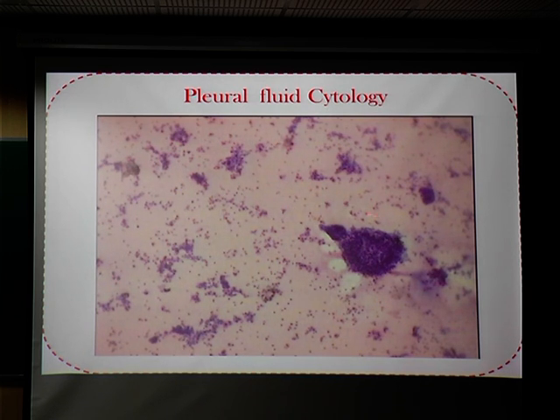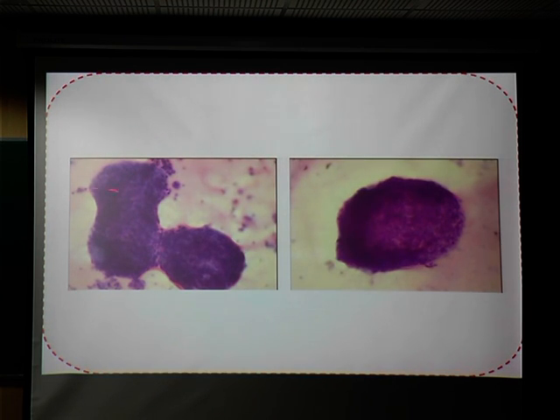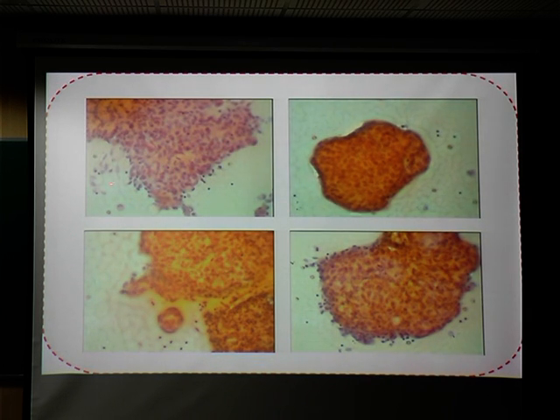You were getting these cell balls or cannon balls or morulas, whatever you would like to call it. And again, see these cannon balls when they are dividing so rapidly and they are creating babies, and when the babies have not been separated, they start looking like papillae. So it's a very difficult situation, but when we looked into these cells under higher magnification, they all appeared spindle in appearance, and there were very few cells that were looking epithelial-like. So here you can see a bit small balls, baby balls, but all of them were composed of spindle cells.